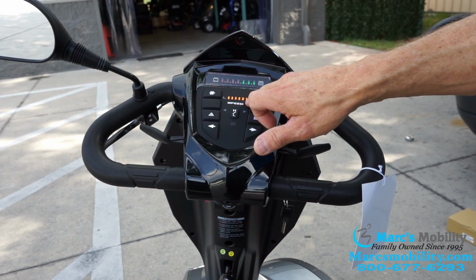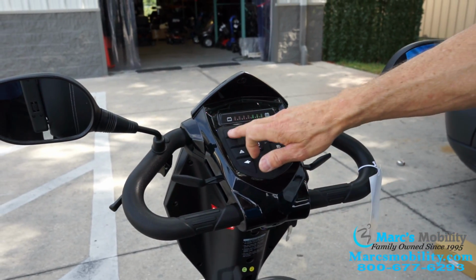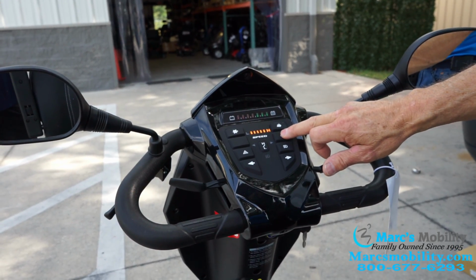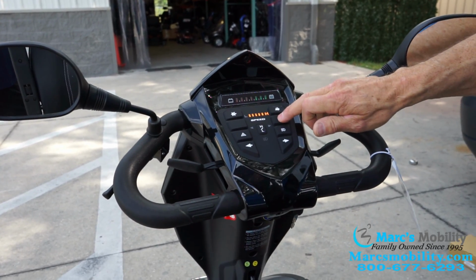This will be high speed. This will be your 10 miles an hour high speed. You have on this scooter, turtle and rabbit, so you can slow the speed down. You can see the lights are going down here and increase it here. You also have a horn, not much of a horn, but there is a horn.